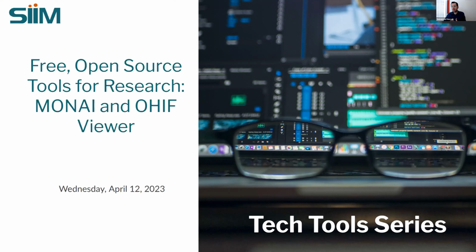And I'm particularly excited about this particular presentation, not only because I've used those tools, but one of the things that excite me about open source software is how integrating multiple pieces of open source software can be more than the sum of its parts. So this is one of the things that we're going to be able to see today.